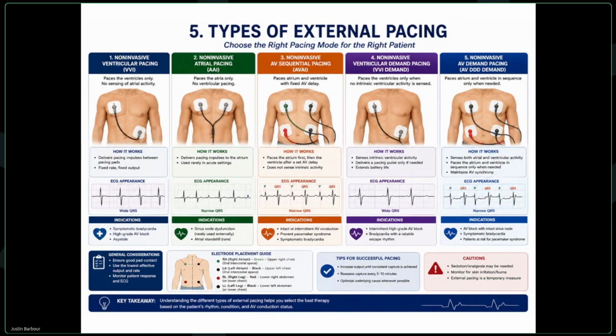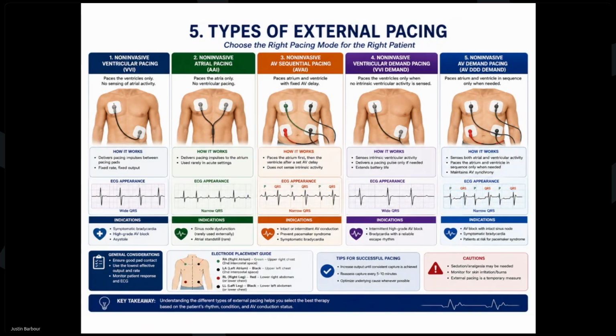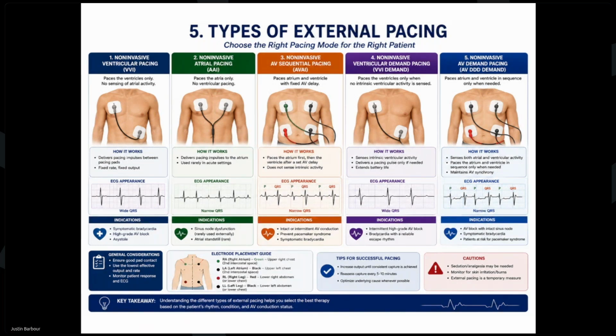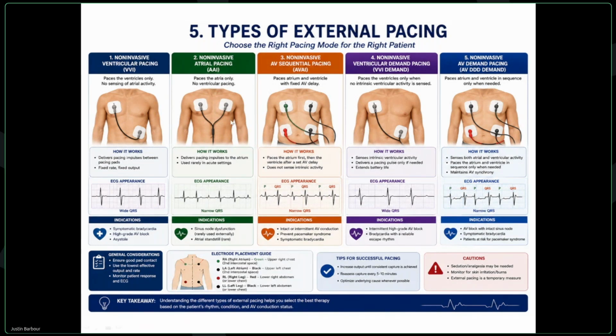And asynchronous, it doesn't matter what the heart's trying to do. You're going to tell it how fast to squeeze, and you're going to tell it how often. And that's pretty much it in a nutshell. There's all different modes because you have 4 chambers of the heart. So sometimes you're going to be monitoring the atria to see if they're trying to squeeze. Other times you might be trying to monitor the ventricles to see if they're trying to squeeze, and that tells the pacemaker what it's supposed to be doing.